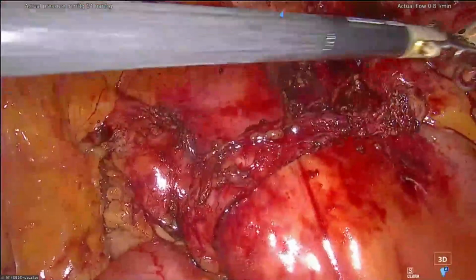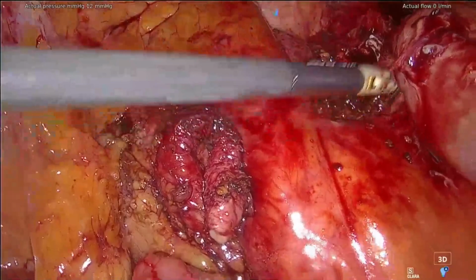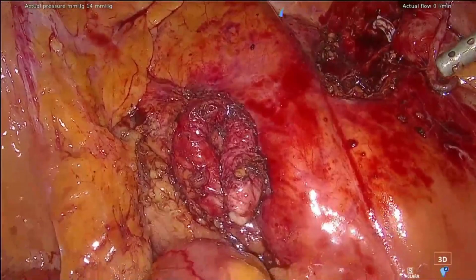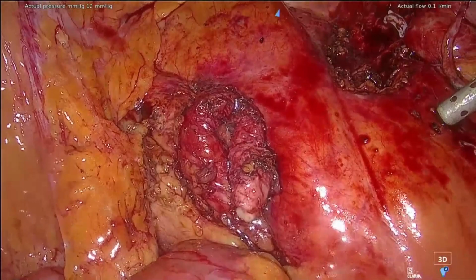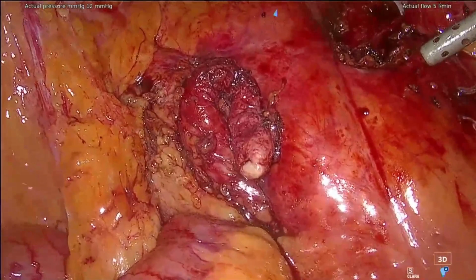When you see this, the bowel will come down. I don't know. Do you inject only with saline or with... Saline is okay. What you have is just liquids. It's just to see, it must be sterile, because it will arrive inside the abdomen. But no blue. After that I have the impression of operating on the Smurfs, everything will be blue. And just water is just to see where the proximal part of the dilatation is localized, just to be sure that I will not leave a stenotic part inside.